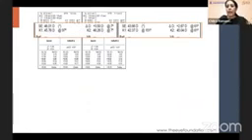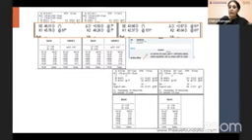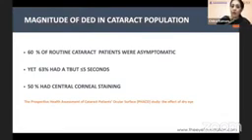Like in this particular case, there was a difference of 2 diopters of astigmatism between the two eyes. And when you examine the eye carefully on the slit lamp, you realize that this was a severe dry eye status. Then when you treated the dry eye and went back and did your measurements, you realize that astigmatism is of similar magnitude in both eyes. And if this was not factored in, your IOL power calculations could have been wrong.